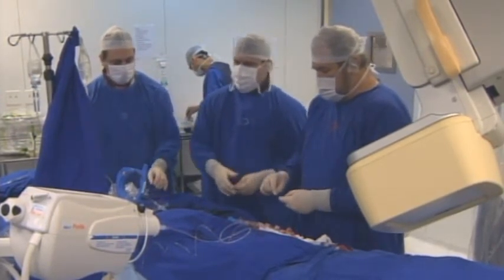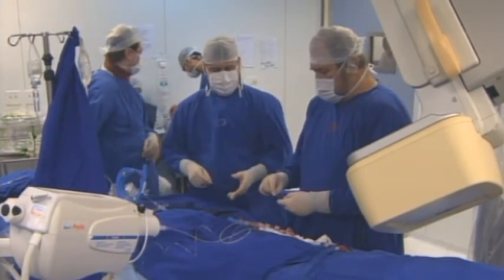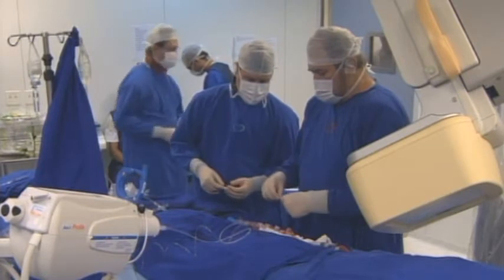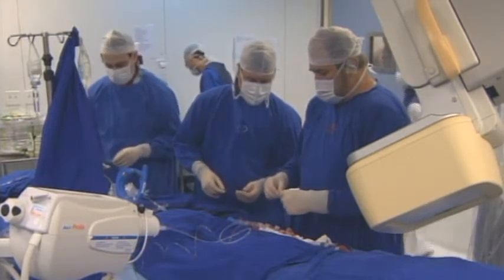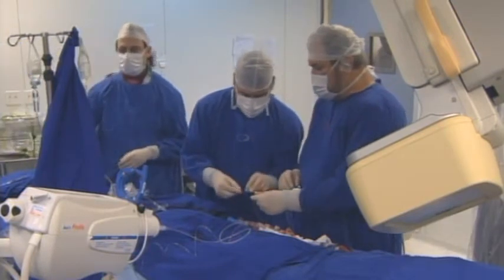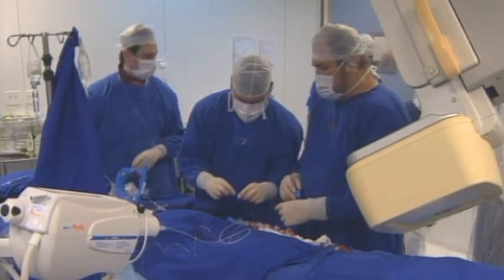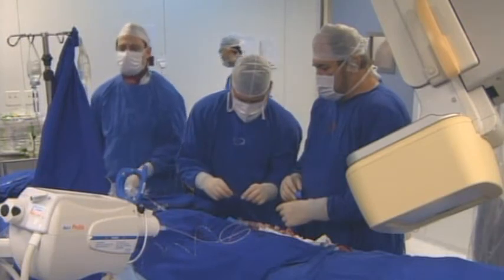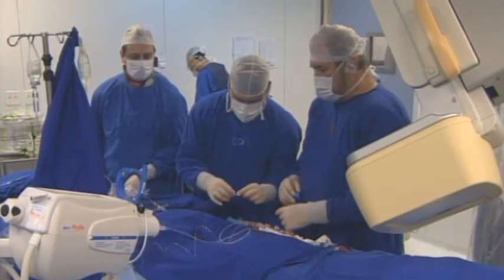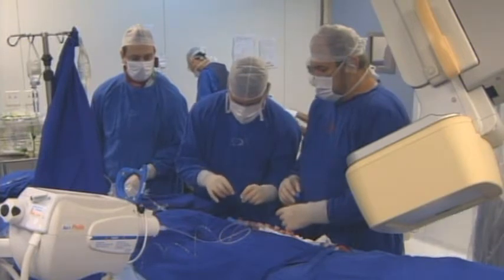We are preparing for the OCT run. For the injection, I see the power injector is connected. The recommendation is power injection, because your image was crisp and clear, which is what is suggested.